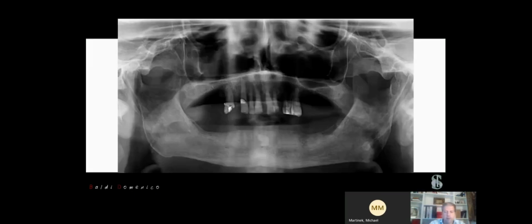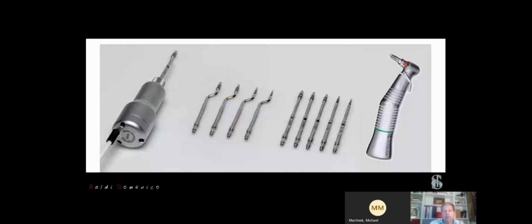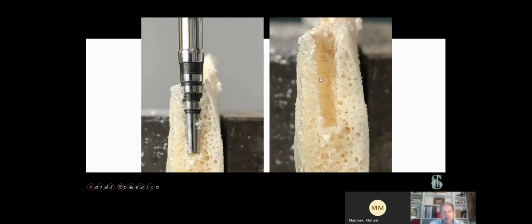So we can start from here using this kind of instrument that is the magnetic mallet. With these tips, we can avoid damage to the bone. And if you use the classical contra-angle with the burr, you understand that it's impossible to be as less invasive as with the magnetic mallet. Again, because with the magnetic mallet, you can perfectly prepare your implant site, but at the same time, you can maintain the quality of the bone, and you can have this kind of result, the osteodensification.